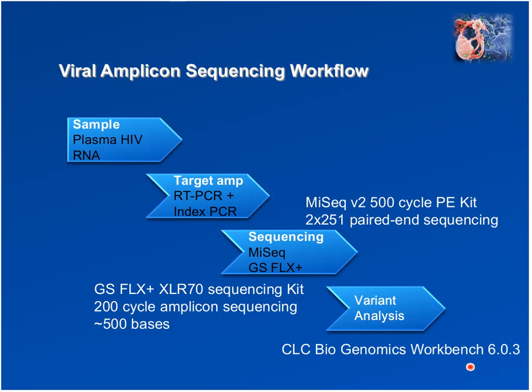I do think that making it actually ready for use in a clinical setting is going to require that consortiums be put together, groups of people who have the same interests and goals in mind, and reproducibility and sensitivity experiments will need to be done, and of course setting of appropriate cutoffs for determination of what is a positive variant frequency result versus what would be considered a negative or non-clinically relevant variant frequency result.